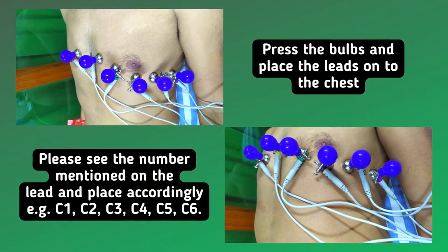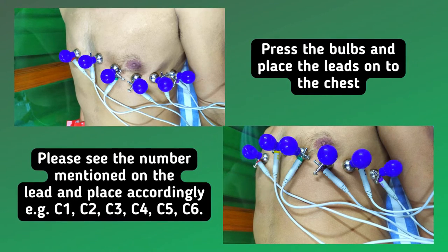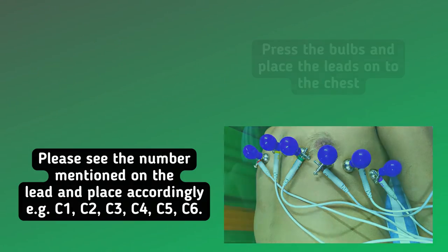Press the bulbs and place the leads onto the chest. Please see the number mentioned on the lead and place accordingly, for example C1, C2, C3, C4, C5, C6.